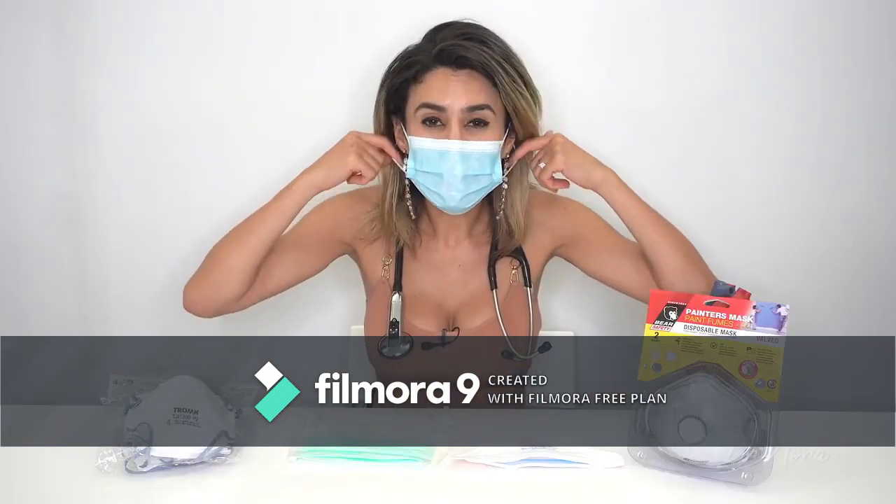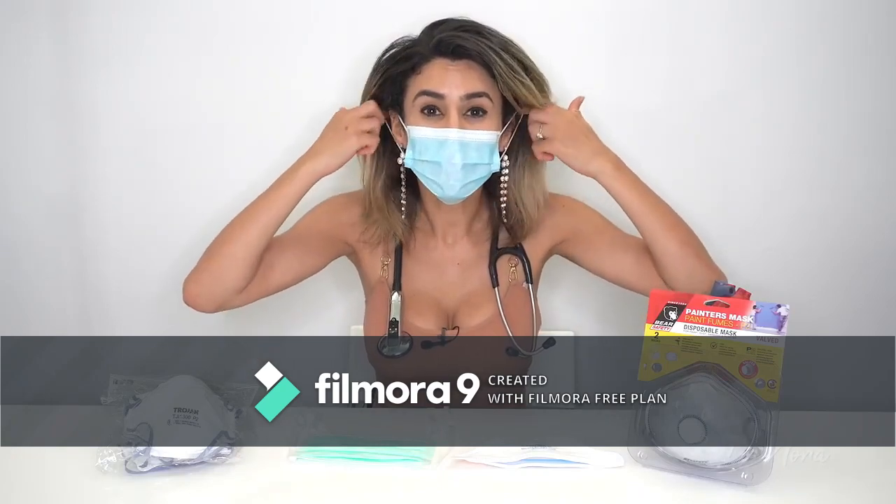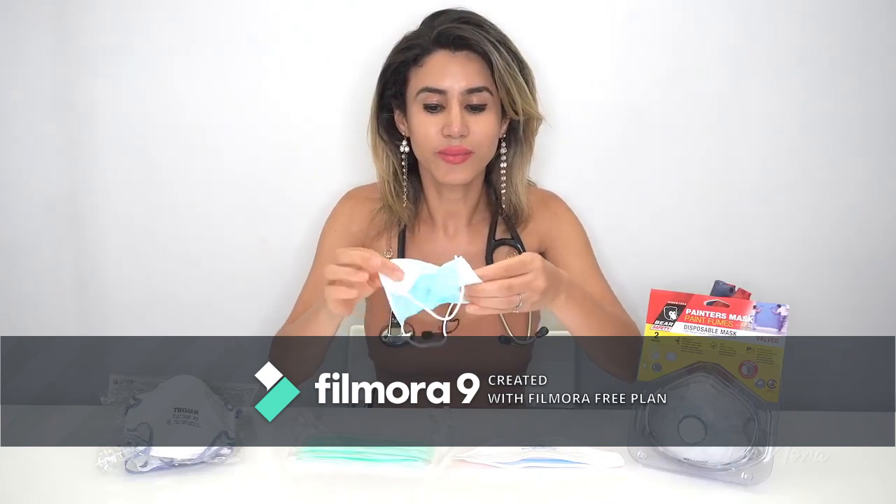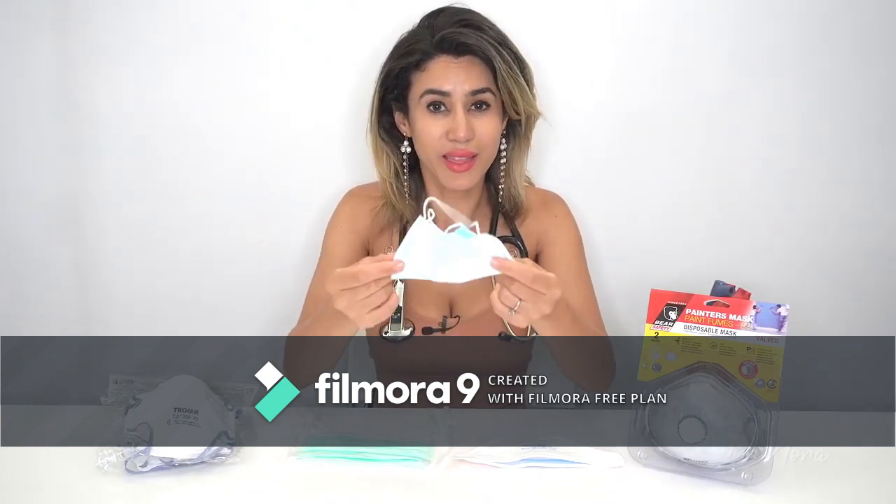That is your surgical mask, and the way that you remove it is by taking it off from your ears, folding it over like so, and disposing of it in the bin.